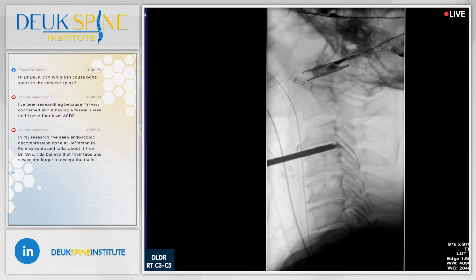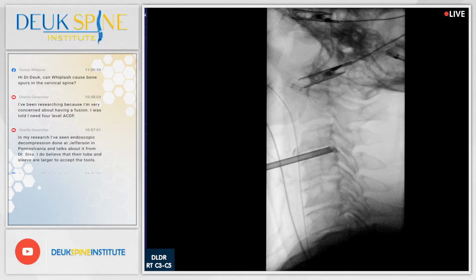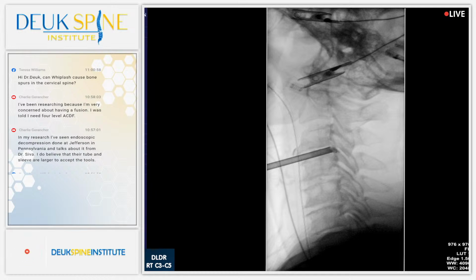All right, we're there. Perfect. So we're at the back of the disc. Jordan, show us on the x-ray where the tip of the tube is, sitting right in the tear and herniation. Any questions? Yes, we have a lot of questions.